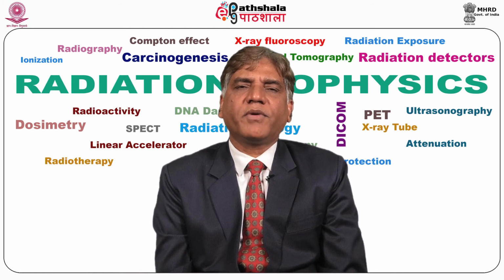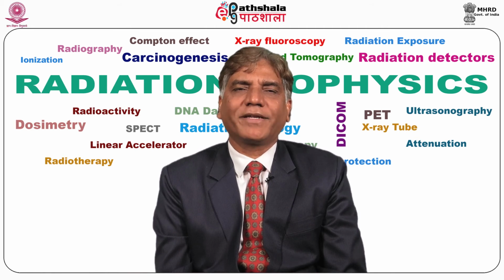Coming to the pulse wave Doppler, it provides the means for detecting the depth at which a returning signal has originated. The depth can be positioned via cursor at any point along the axis of the pulse Doppler beam.